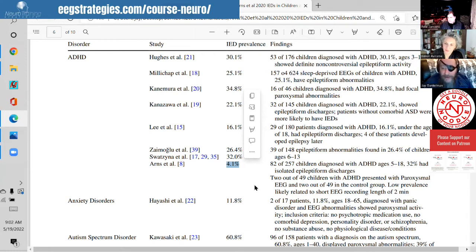The reason that the 20 to 30 minute standard was set was that the doctors and techs decided that if you do too short a study, you're likely not to see a transient, a rare discharge. And how long do you need to get half a chance of seeing it? 20 minutes gives you a little over 50% chance of seeing a discharge in a known epileptic. So a 2-minute study is inadequate. A 5-minute study is better than 2, but it isn't quite there yet.